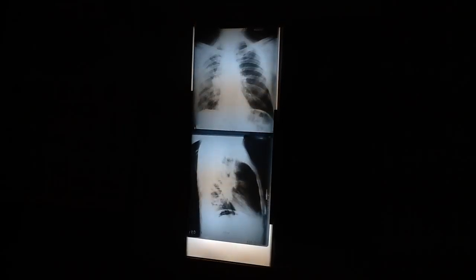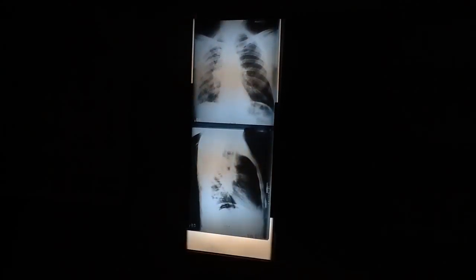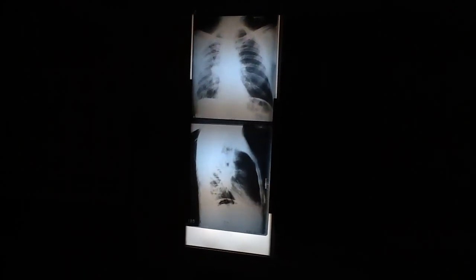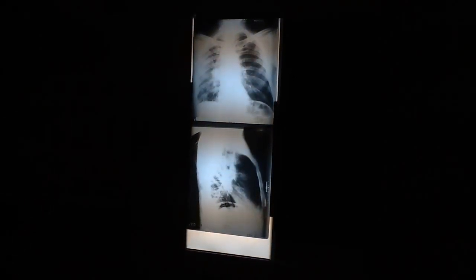And then the last sign, number 7, dealt with what? Probably one of the most classic signs, the unilateral localized density, yes, but the nodular type, where it's circular, oval, and well-defined. That's what we talked about. And so we actually have some examples of those things here today.